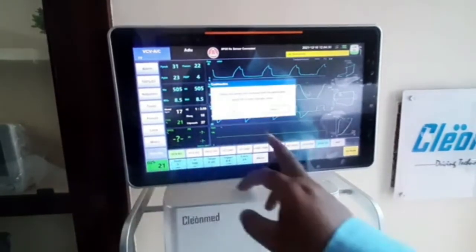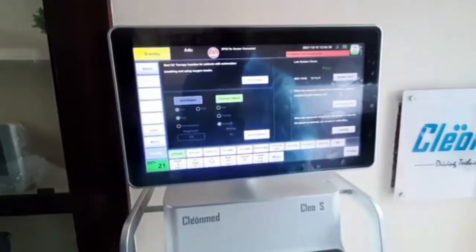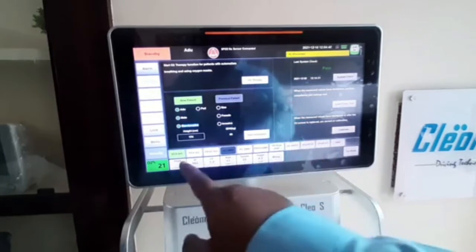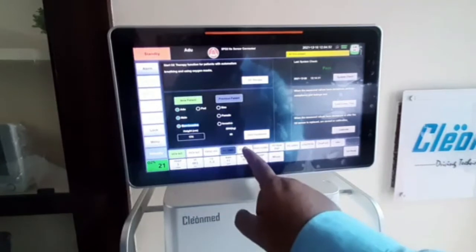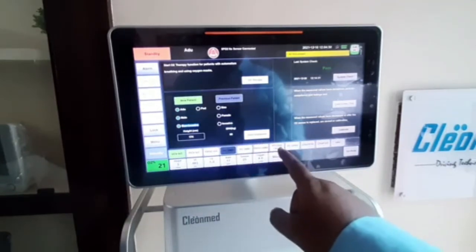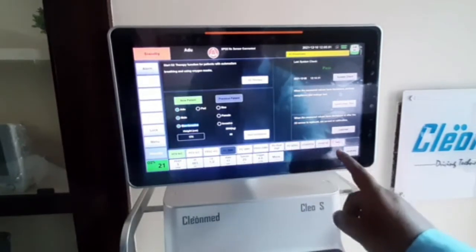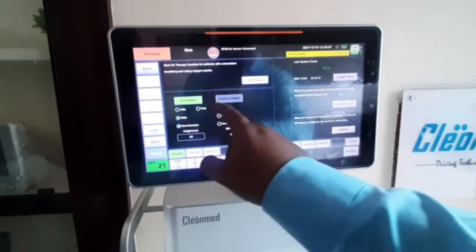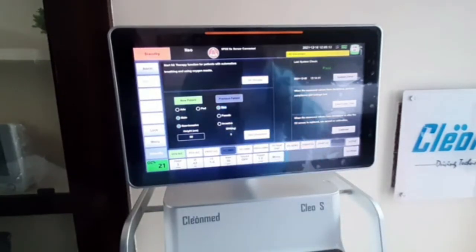Now let's see what are the modes that are present in non-invasive. New patient, non-invasive. In non-invasive also you get a range of modes like volume control, pressure control, PRVC, pressure SIMV, PRVC SIMV, pressure DuoPAP, PRVC, CPAP PSV, CPAP volume control and AMV. This non-invasive CPAP is only activated when you are selecting non-invasive neonatal modes, where you get an additional mode that is nasal CPAP.